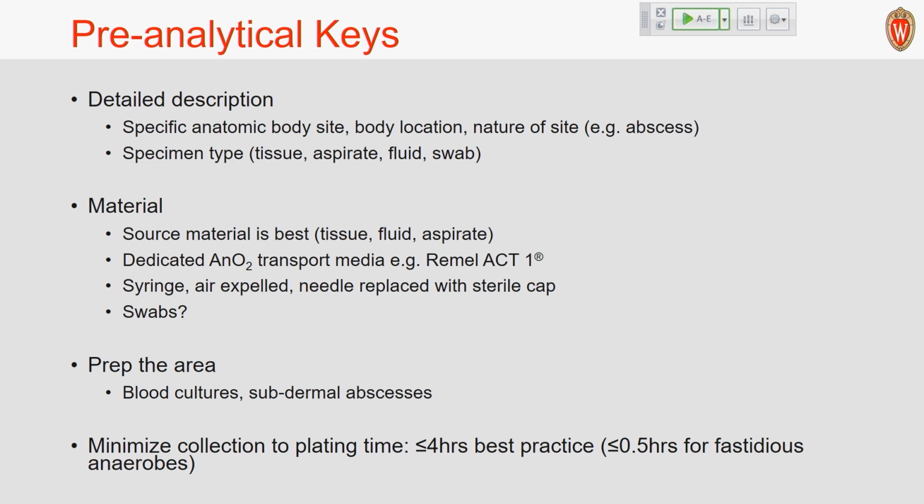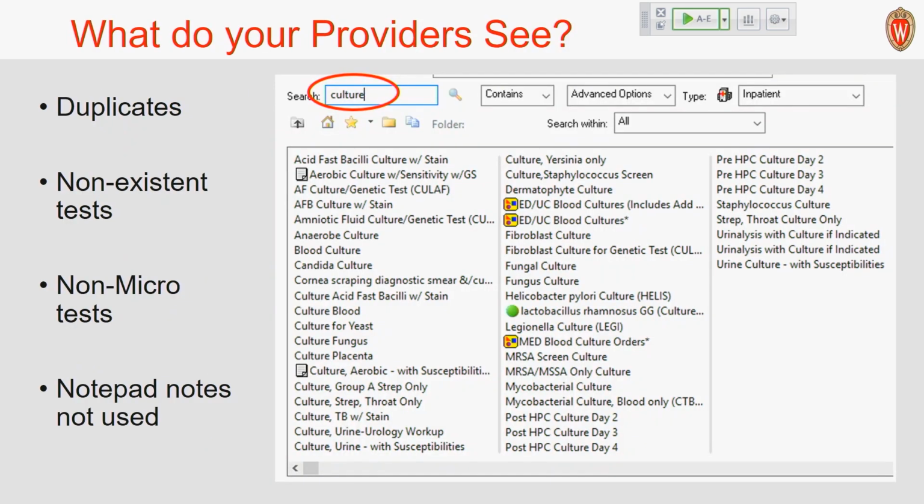And even if you have a lot of sites and you're a centralized lab, you might think about traveling incubators. We put that system in. It's worked out fairly well. We've got it down where the local lab, the collecting lab, does the plating and the initial incubation. They put it into this heated incubator, and then the courier brings it to us. So it's seamless. When it gets to us, typically the timing is ready where we can start working on those cultures, and even the timing is right for susceptibility testing.